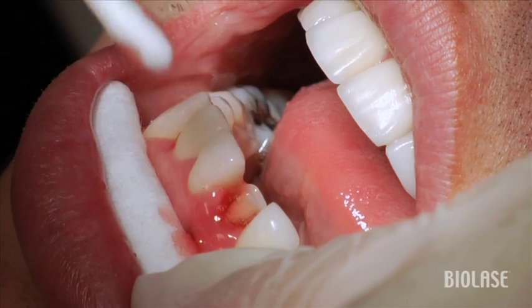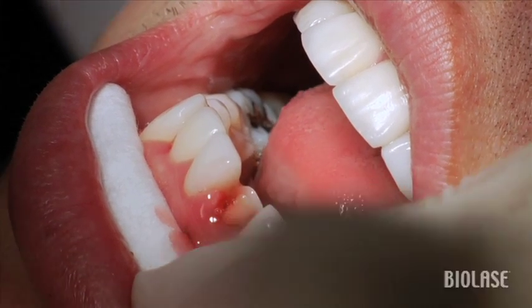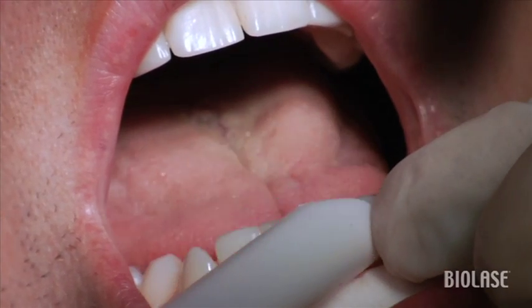Using the eye lase, we can use just topical anesthetic — it's a strong topical anesthetic. Leave it on for about a minute and suction it.